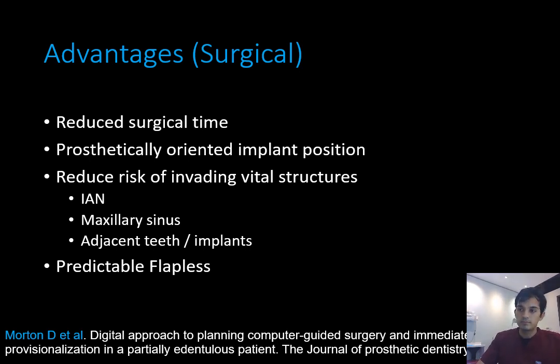Remember, there's only one way you can drill when you have a fully guided case, and that's where you've made your prosthetic plan, provided your guide has seated all the way down. So there's no unnecessary correction of your angulation, which typically used to take the longest time for me prior to going into guided surgeries. You know that where you drill is where the implant is supposed to go.